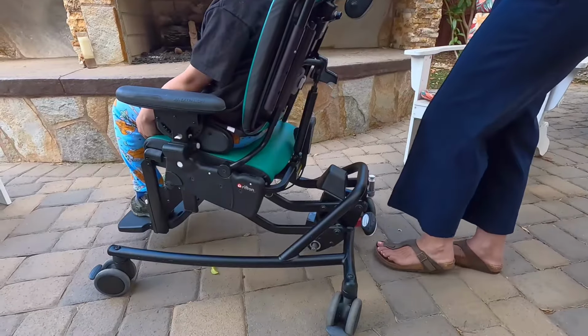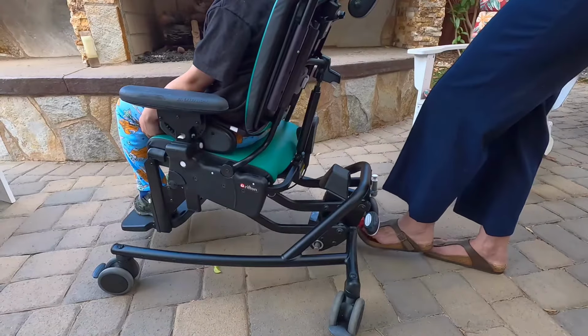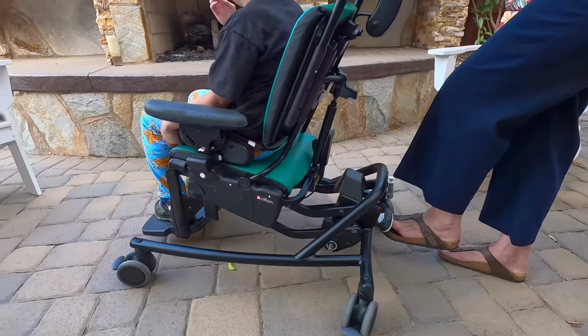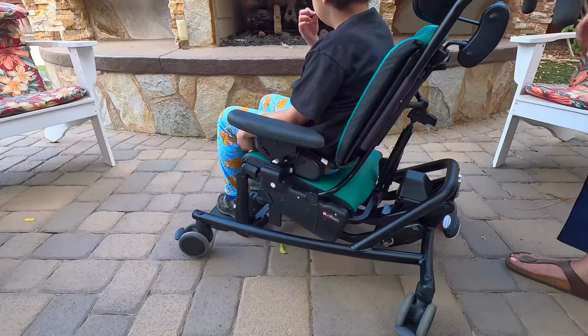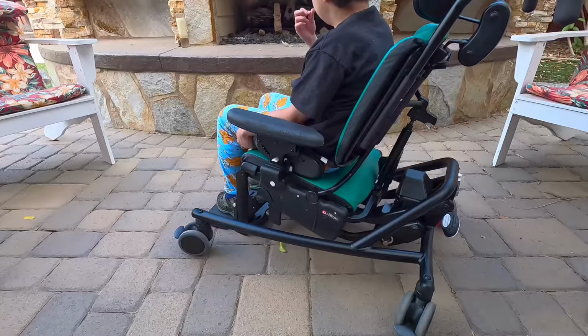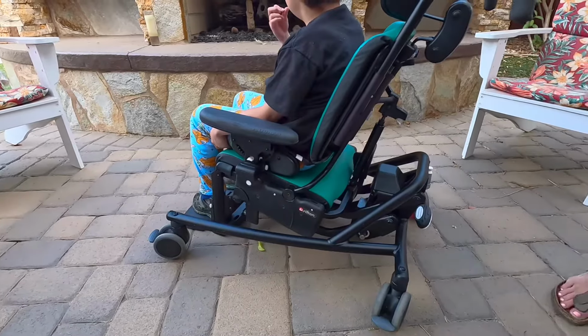Now if you want to lower all the way to the ground, you lift both the white part and the little red trigger. You can tell if you caught it because you'll see it from above, and as you can see, the chair will go all the way down. So it's important to not stop when the footrest hits the ground, but to let the whole chair go and the back will drop more.